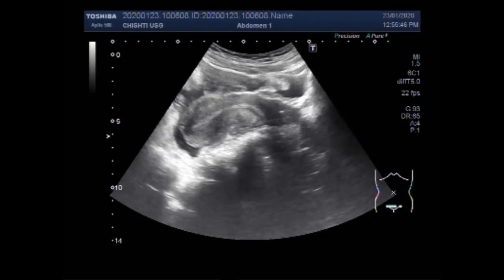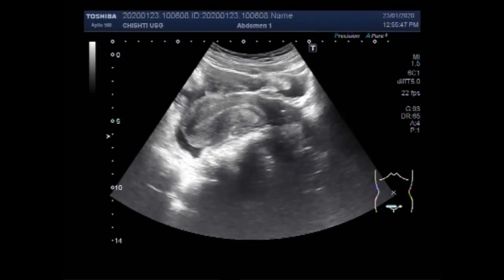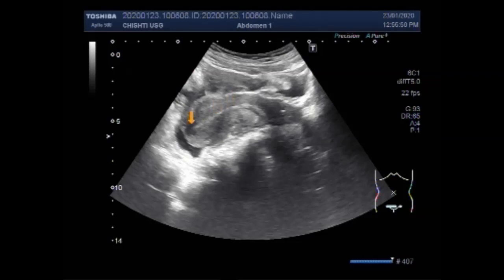You can see the uterus. This is the uterus. This is the cervix and this is the urinary bladder.